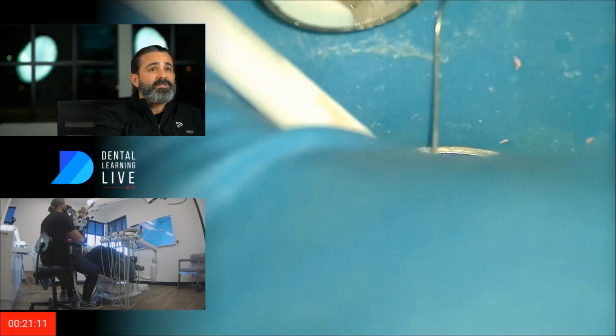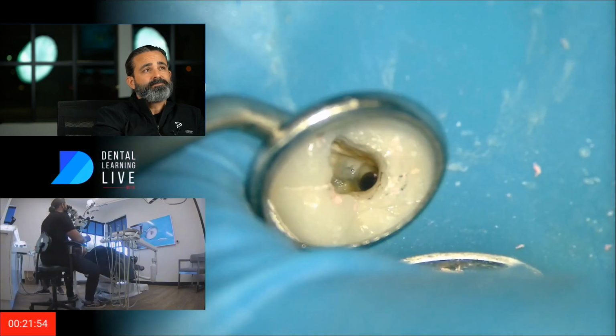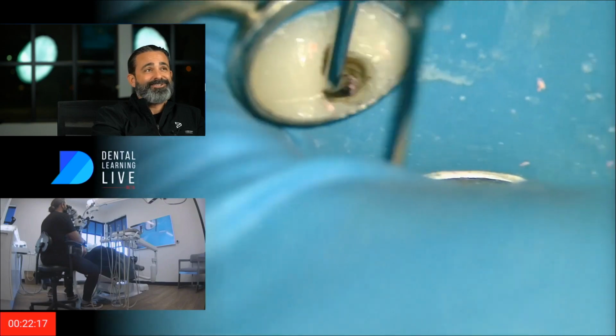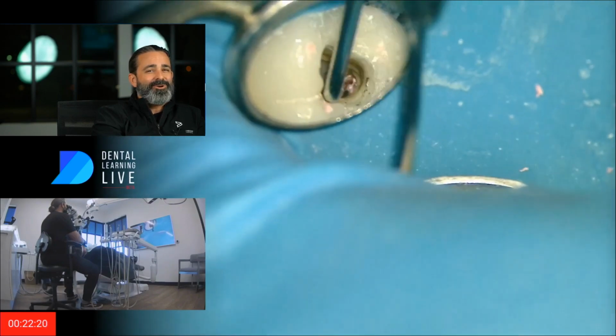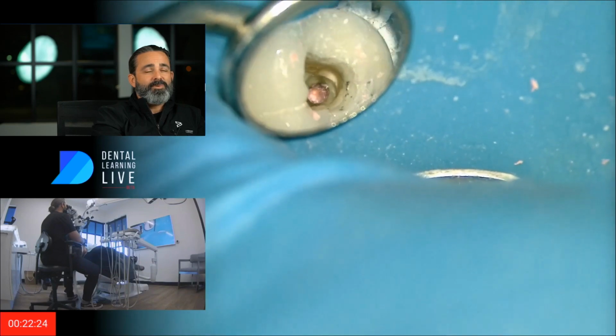So we'll go ahead and get this all cleaned up. Yep, it's still there. It's frustrating. People don't realize how hard our job really is at times, and certainly when you want to be a perfectionist.